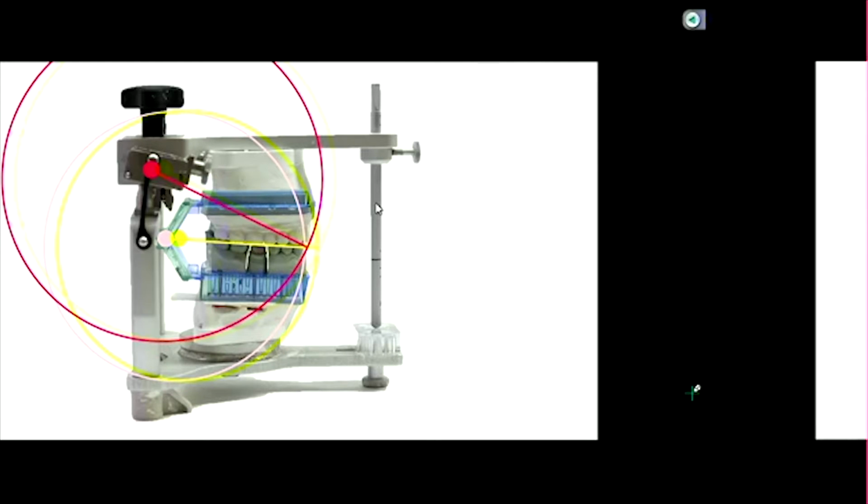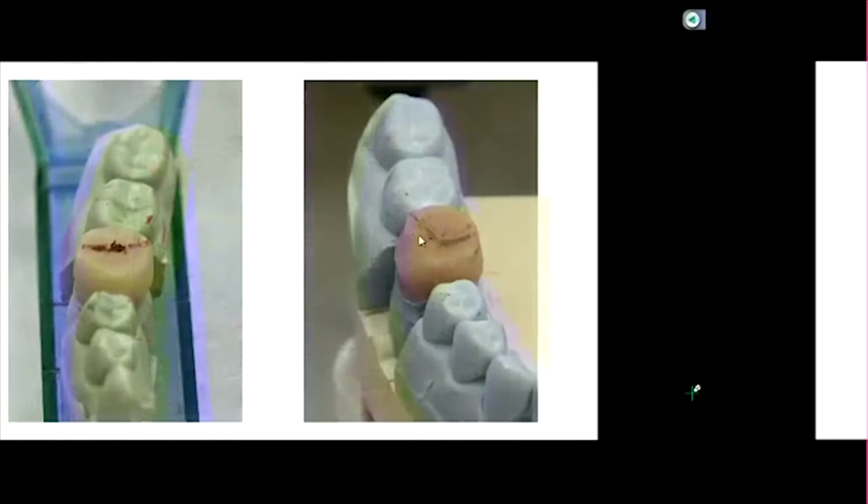So as you go into those movements, see the picture on the right side? I've drawn it a little deeper in pencil, but that's the movement. The cusp that is marking this, in the central fossa, is your distal lingual cusp of the maxillary molar. So this is what we're tracking. In working and non-working movements, you get this path that cusp follows. We'll say that this is what the patient is actually doing in their mouth, right?